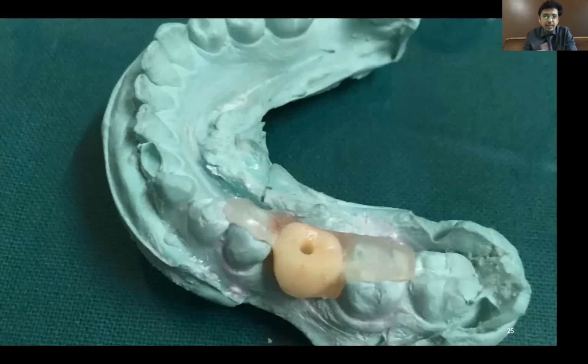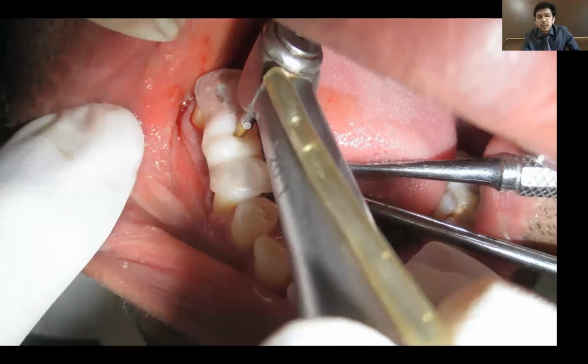In the beginning few cases, ideally you would be needing something known as a surgical stent or a prosthetic stent, even with regard to single tooth cases. Later on, with regard to single tooth, you won't be requiring it. This was how, more than 10 years back, we used to make it from a documentation point of view. But later on, the problem we used to face with this type of surgical stent was, the moment we placed it at the time of surgery, we were completely blind. I couldn't see where my drill was actually hitting the bone.